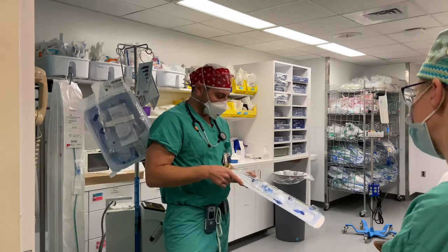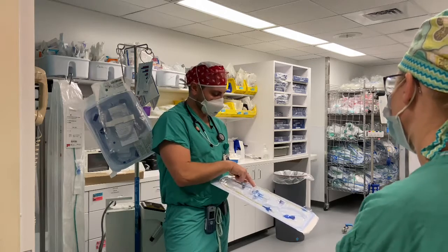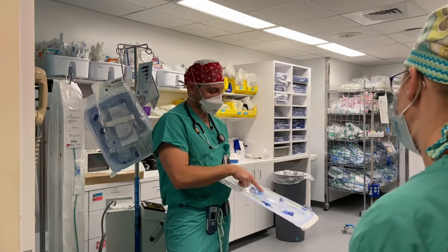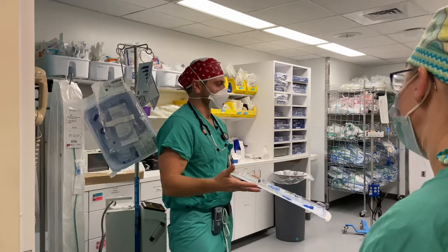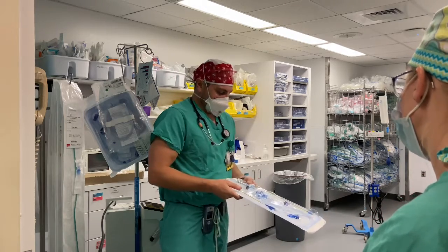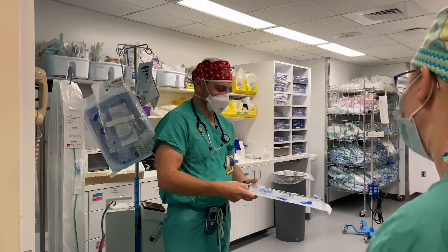Probably the most common thing people do is screw up these two. Okay, so they'll put their scope down here and their blocker down here. They get it where they want it if they're lucky, and then they let go and it moves out of position.